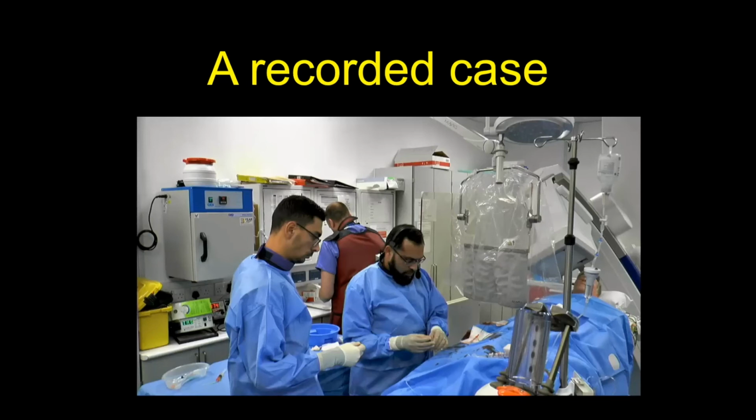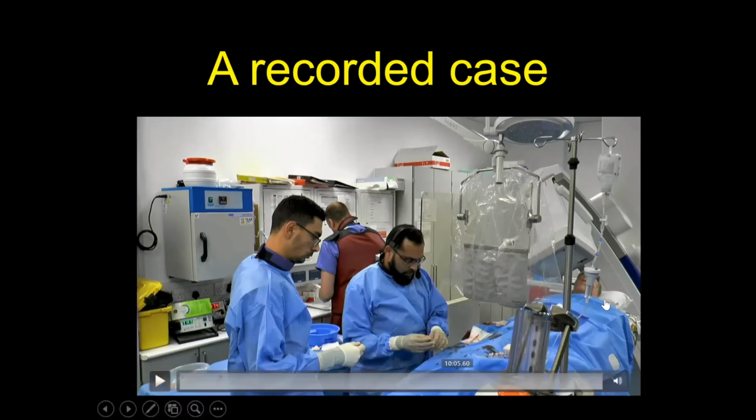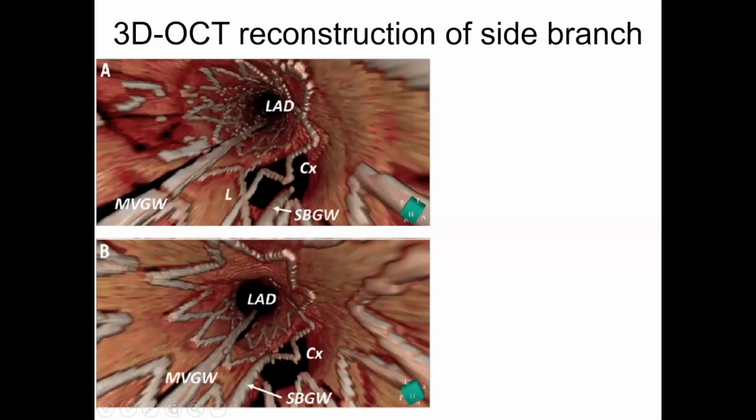Fine. If anybody wanted, I can send it. The video was more about how to set up the OCT, because I think it's easier to show it rather than talking about it, and also the software that the OCT systems use, both in terms of the stent malapposition and things. We will share this whole session later on YouTube, and people can watch there.